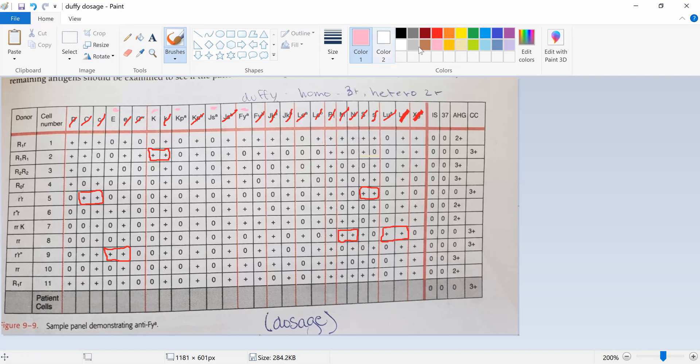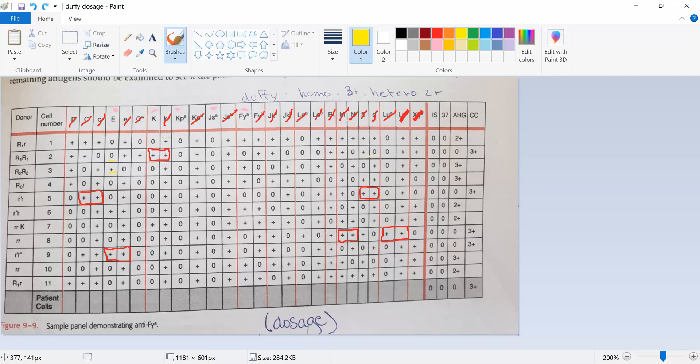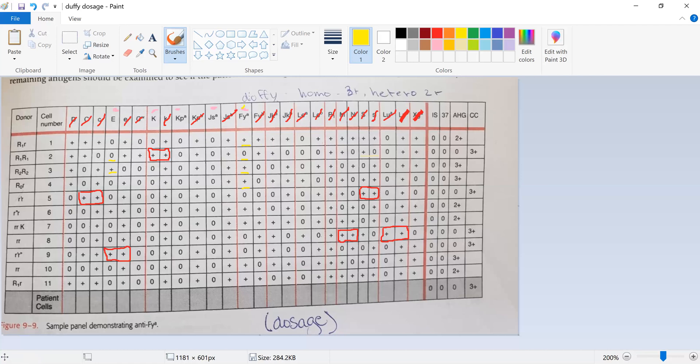Okay, so now we have all of our ones that cannot be ruled out, but now we need to see which one matches. So we've got for E, the first one's negative, so that doesn't match. Second one's negative, that one matches. Positive, positive, nope, the only one that matches there. So that one's not matching too well. KEL, we've got negative first. Nope, that one doesn't match. Positive matches. Or, I'm sorry, I had it explored, didn't I? FYA. Yep. JSA, KPA don't match, but your Duffy A matches all the way down. So you've got a positive, negative, positive, positive. So that one matches all the way down. So we know it's probably going to be our Duffy A.